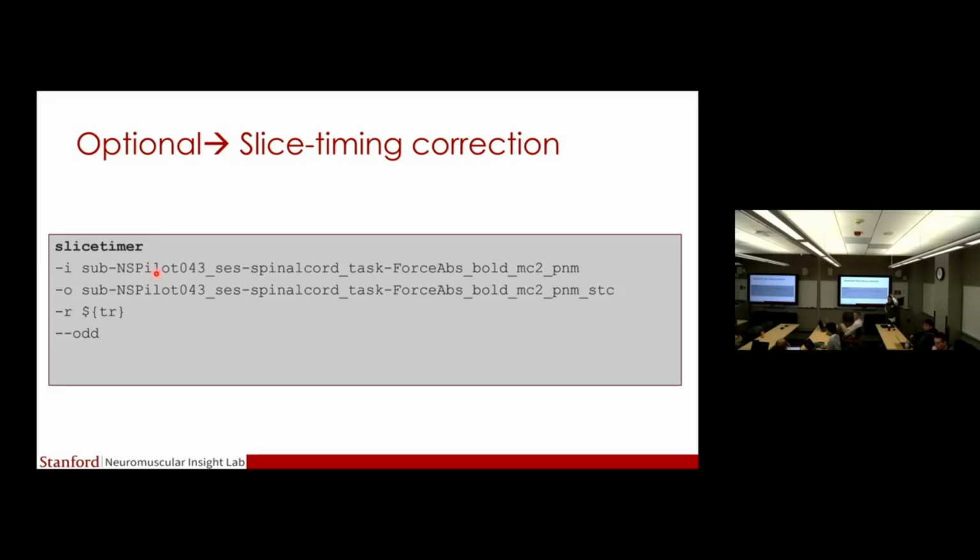When you say optional, you're talking about when is the correct time to apply it. It's not whether we apply it that is optional. I will be honest, I said it's optional, but I know Gary said you have to apply it; not applying would be stupid. I know there are strong opinions on that, but for my PhD data with a TR of 2.5 seconds, we didn't apply it. That might be wrong.